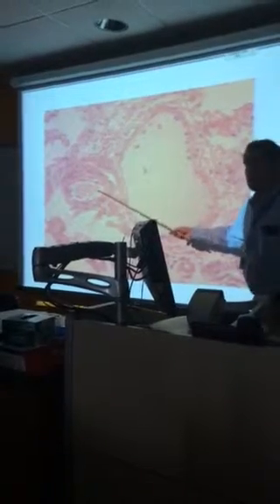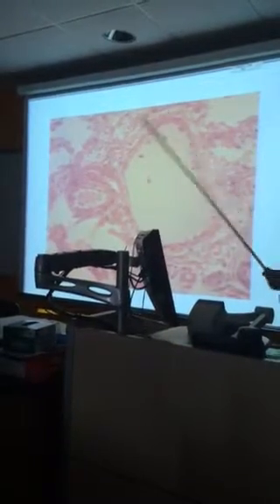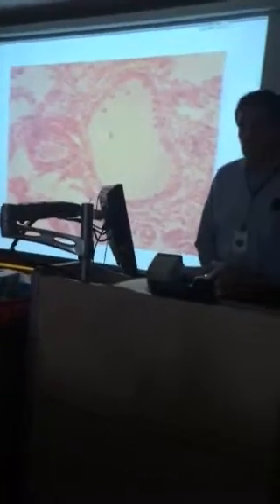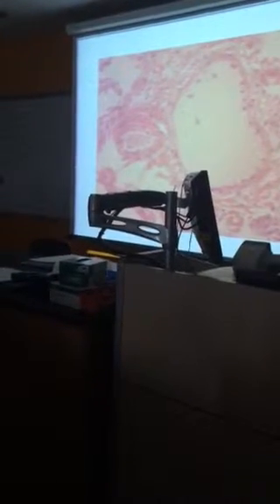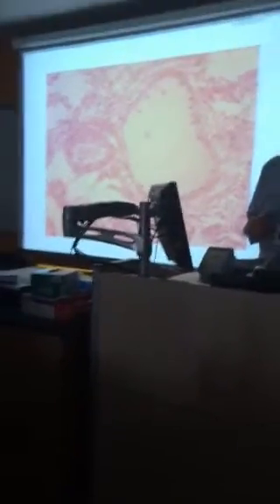The other vessel here is an arteriole, a small artery. You can see, thick wall, relatively small lumen, as opposed to thin wall and large lumen of the venule. This is a hepatic arteriole, and contrary to what your book says, it is not a portal arteriole. A portal vessel basically goes from capillary bed to capillary bed. This does not. It's a small branch off of the hepatic artery. So don't call it hepatic artery, call it hepatic arteriole. This you might expect is bringing oxygen-rich blood, as you'd expect an artery to do. So in your book where it says portal arteriole, please change that to hepatic arteriole.